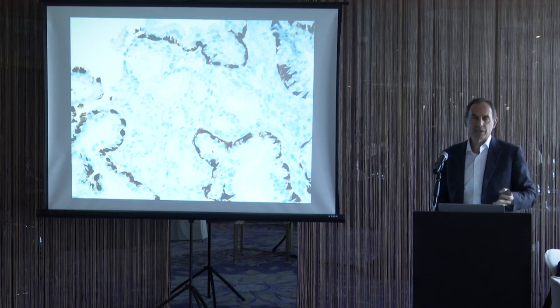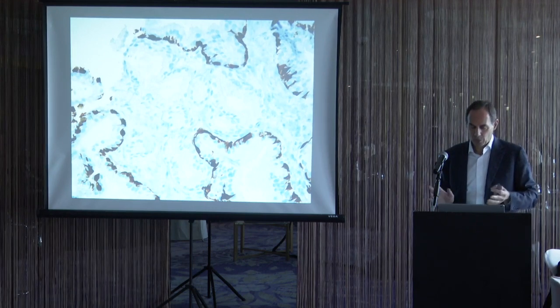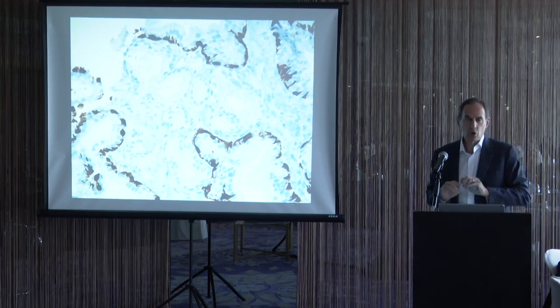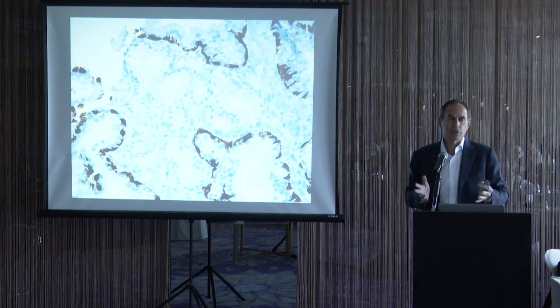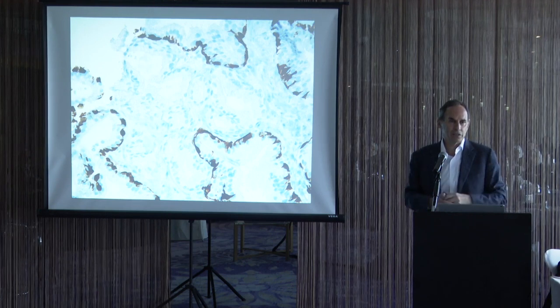When you do the special stains, basal cell markers, high molecular weight keratin and P63, totally negative in those small crowded glands tucked in between the benign glands, I would use that to be definitive to say this is prostate cancer.